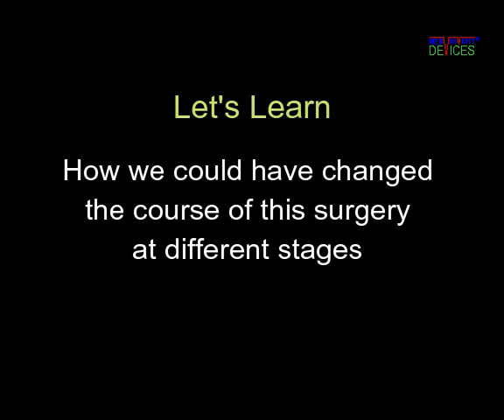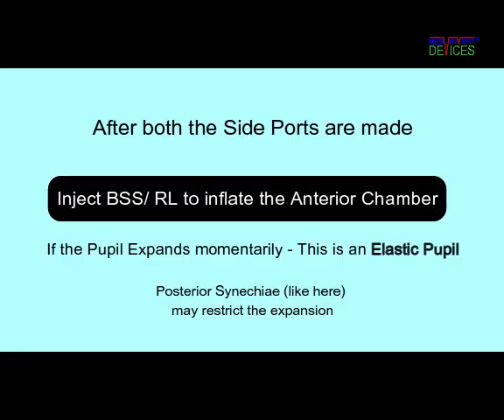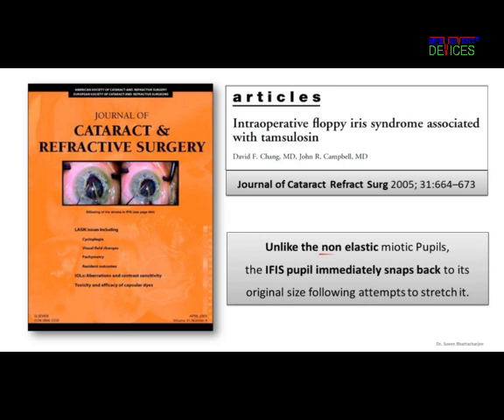Let's learn how we could help this surgeon for the next B-Hex case. Once the two side ports are made, it is an opportunity to assess the nature of the pupil. When the anterior chamber is inflated with viscoelastic, if the pupil expands momentarily, it is an elastic pupil. Chang and Campbell, in this landmark paper, taught us that unlike the non-elastic miotic pupil, the IFIS pupil is elastic.